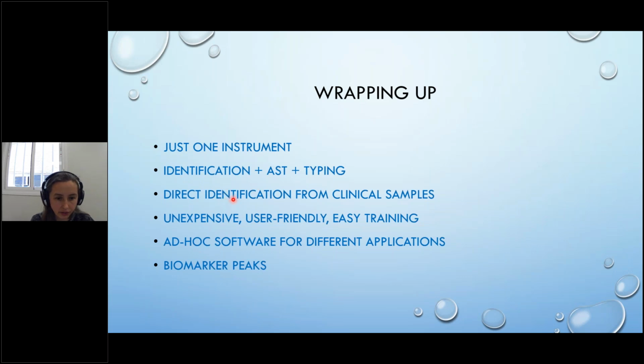So direct identification for clinical samples is one of the main applications that you can also apply using the same machine. Besides, it's inexpensive, it's user friendly, and requires very short and very easy training. So ad hoc software for different applications is coming up. It's being developed, and it will help in the future to perform these different applications in a more user friendly way.